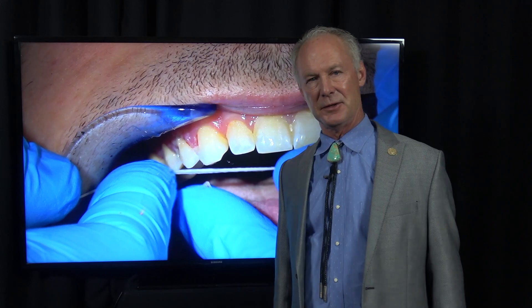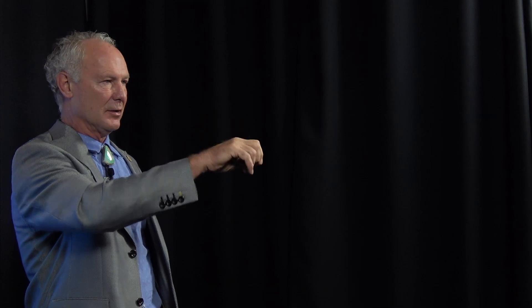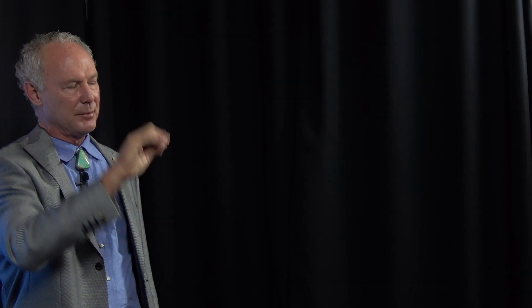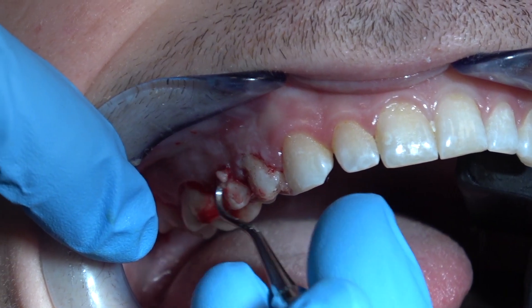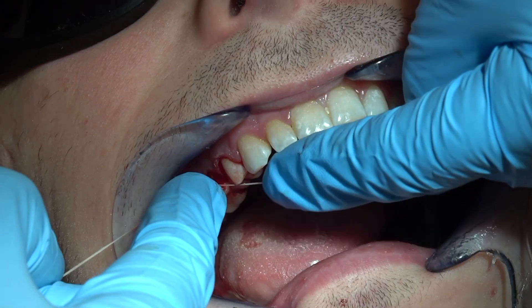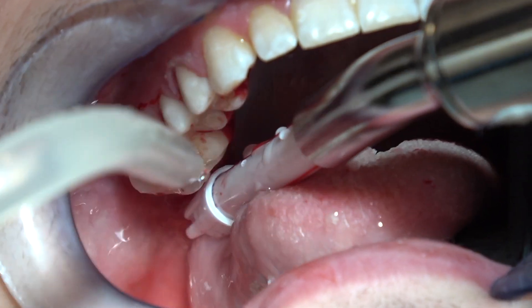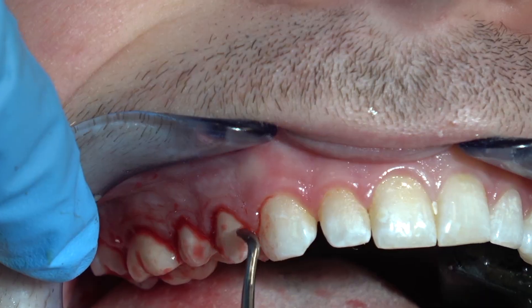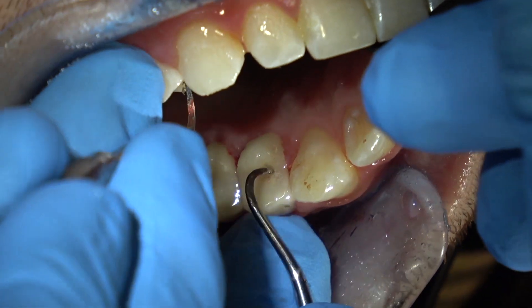Let the excess cement set initially — not completely, because that's too hard to remove — just set initially so you can peel it off. You don't wipe it off. Use the back end of a scaler and it just peels off. Once it peels off, that cement has completely set in the micro gap and it's sealed, so you won't get sensitivity, decay, or staining. I'm only popping through the contacts. We're bleeding like a stuck pig again because we're removing the excess cement, but it doesn't matter because the crowns are securely and completely seated. Use an amalgam carver and a scaler — those are very good for removing excess cement from the crown. You can see we've got perfect contacts here.